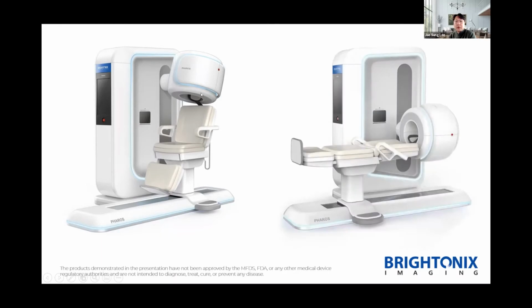And we can change the position of the PET detector head like this to allow the patient to be scanned in the supine position as well, for older patients who have difficulty sitting in chairs or something like that. Anyway, it requires a minimal footprint for the system installation because of its compact size, and because we don't need any separate machine room for system cooling, parallel computation, or image reconstruction or something like that.